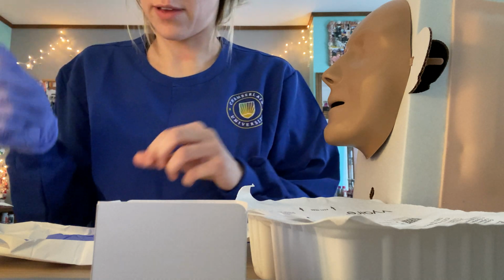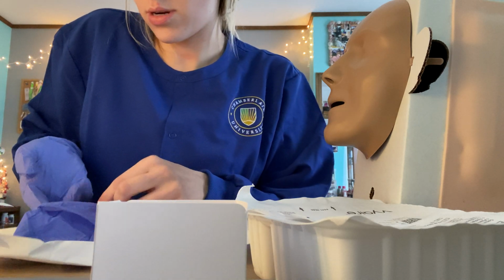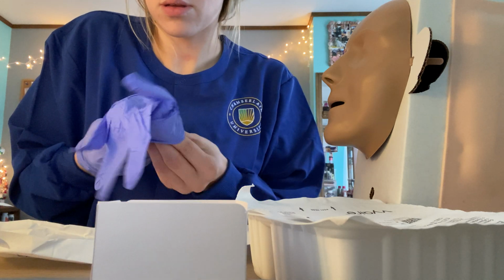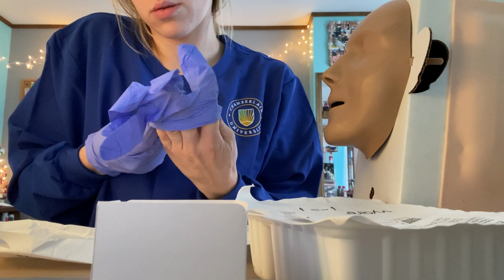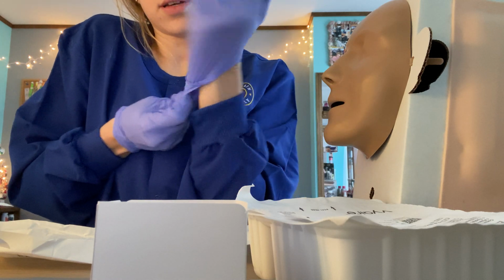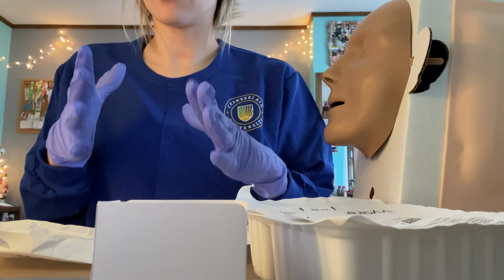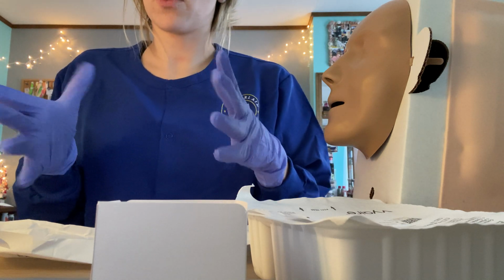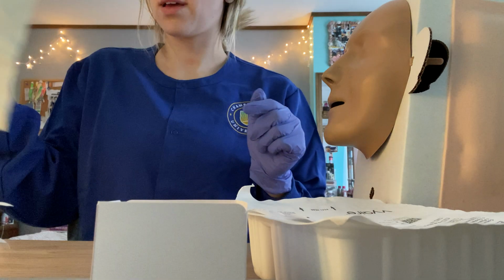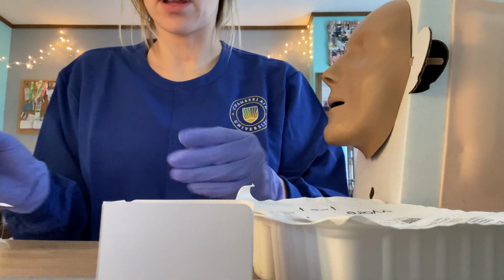Okay, it's not perfect, but I can fix it. Okay, so now scoop under. Sterile still. Okay, all right, so I have my sterile gloves put on. Now that's going to be moved out of the way. I wouldn't touch that with my sterile gloves either, by the way.